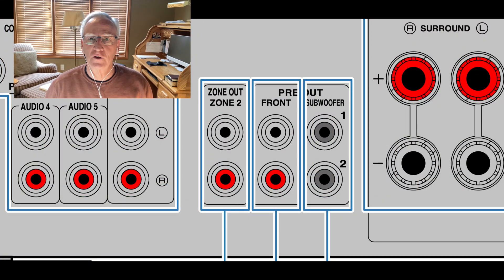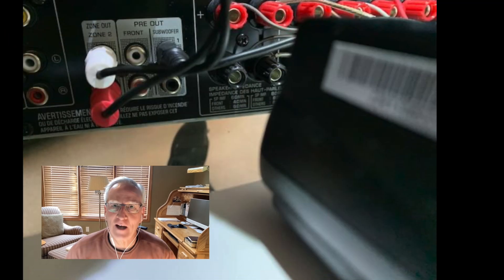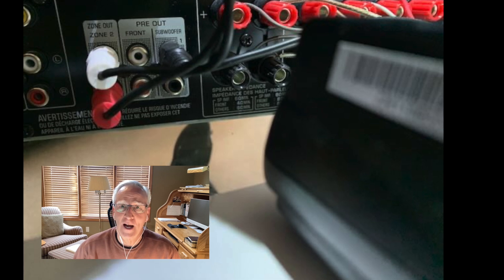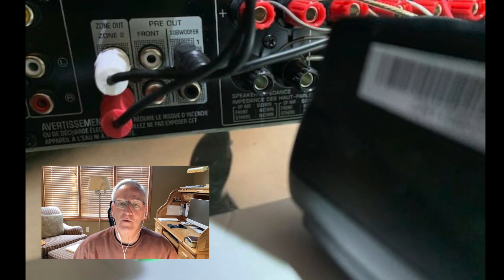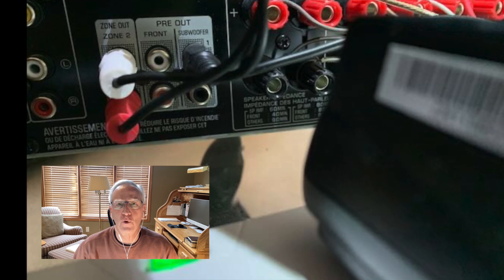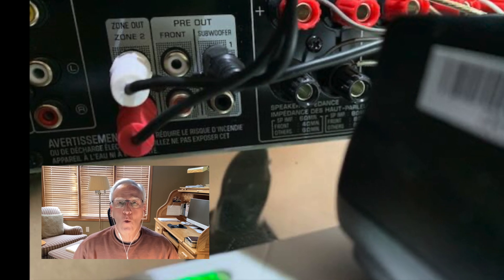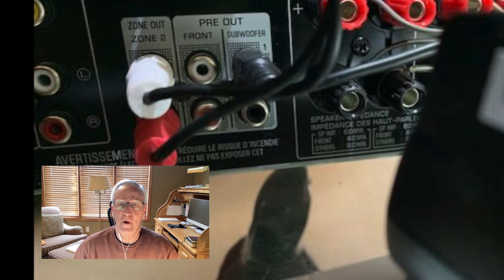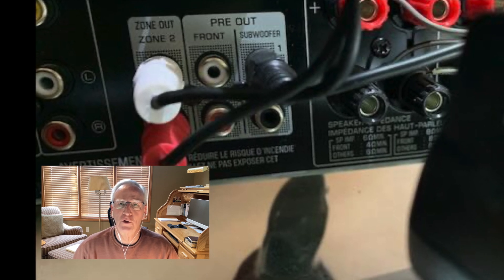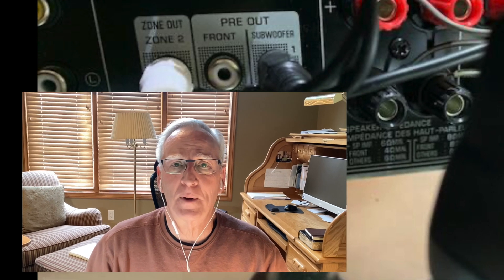I'm showing here an illustration from my manual of what the back of my AV receiver looks like. You can see the actual back, and identified here are what are called Zone Out Zone 2. These are typically used in an AV receiver if you want a second set of speakers playing to a different room. But we want to use Zone 2 for the streaming device for your hearing aids. The other end of that patch cord will plug into those two jacks, and that completes the hardware setup.